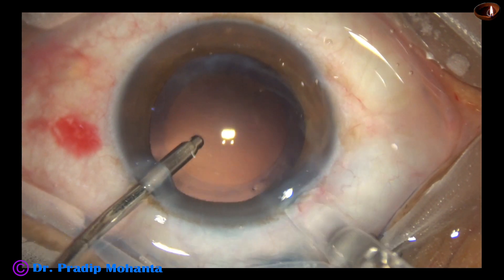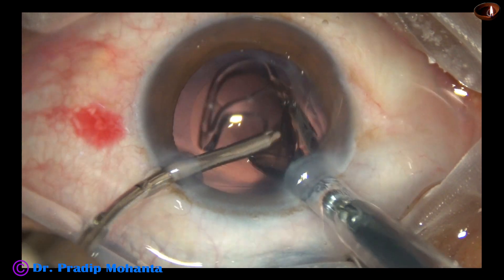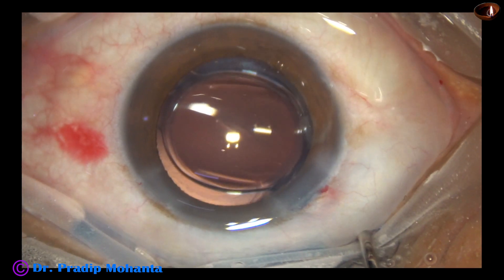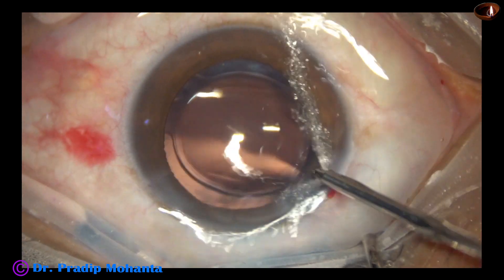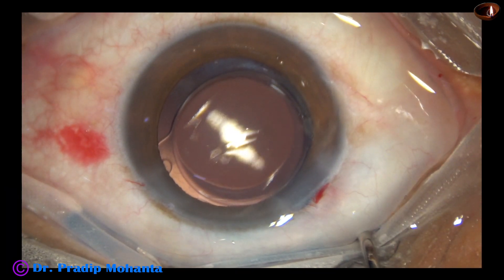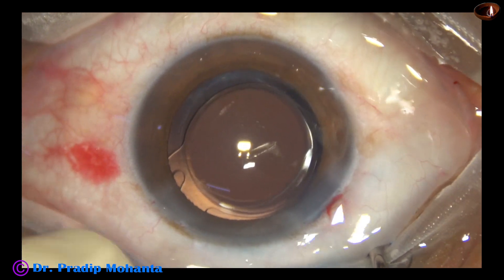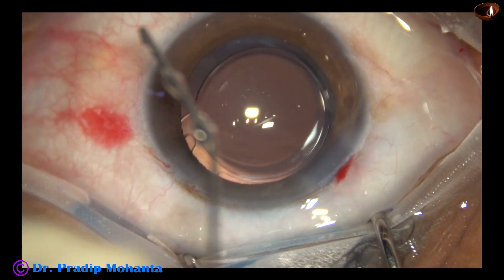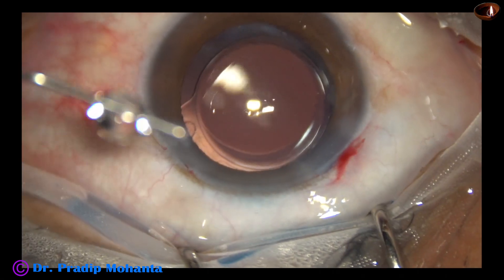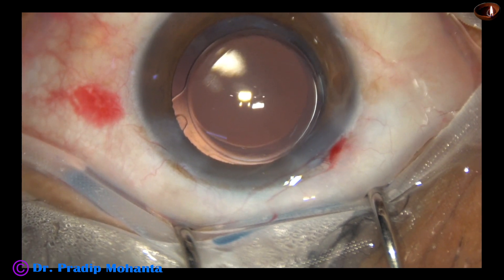Now this is hydro-implantation of a single-piece monofocal intraocular lens. By a push of the left-hand instrument, the trailing haptic goes into the capsular bag. The lens is dialed. The advantage of hydro-implantation is we do not have to spend a lot of time to remove the viscoelastic. Whatever little viscoelastic is there in the lumen of the cartridge comes out just by irrigation.